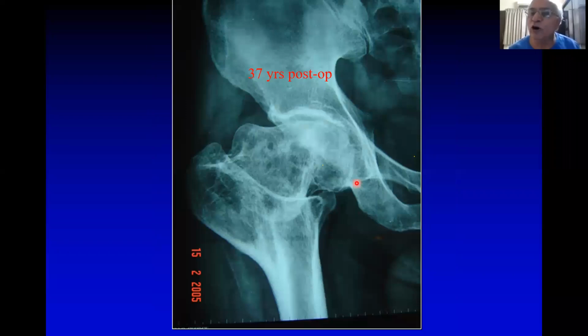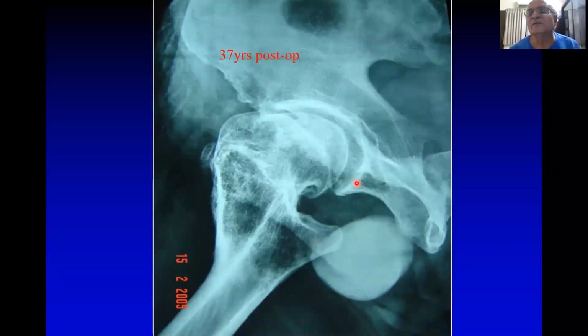Most technicians do not know. I'm going to show you the lateral X-ray of this patient. The AP looks fantastic. Srikunj Bhai says, do the operation tomorrow. So everything is available. But look at this lateral X-ray. There is no way you can negotiate inside. So that is the thing which happened with this patient. Now, if you have to do it, we have to do a re-osteotomy or get the trochanter out, do a trochanteric detachment, try to get the medial, sometimes a customized implant, a custom implant.